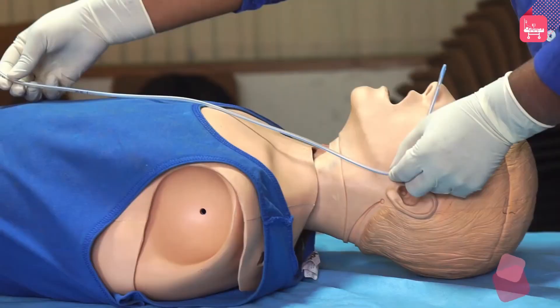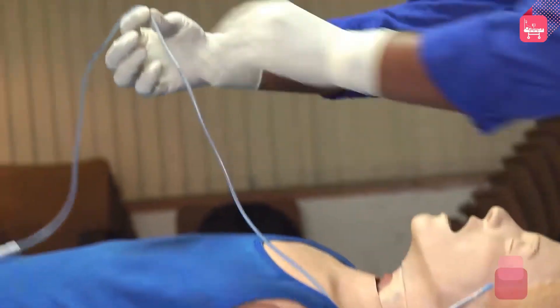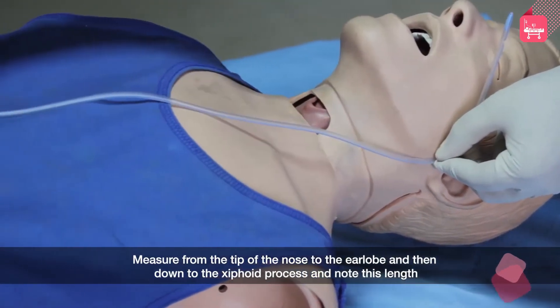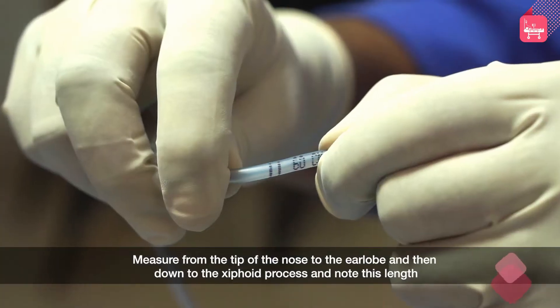To determine the length of nasogastric tube to be inserted, use it like a measuring device. Measure from the tip of the nose to the earlobe and then down to the xiphoid process. Note this length.